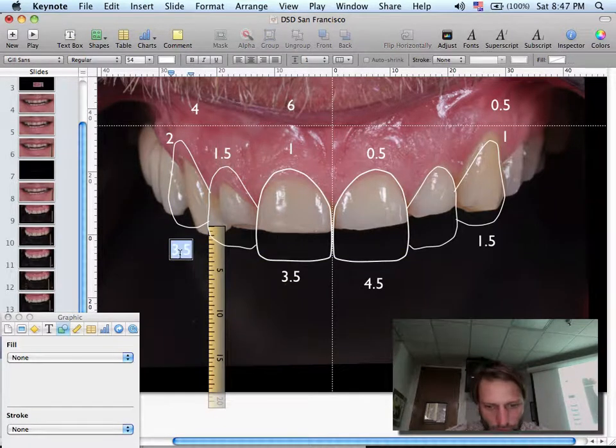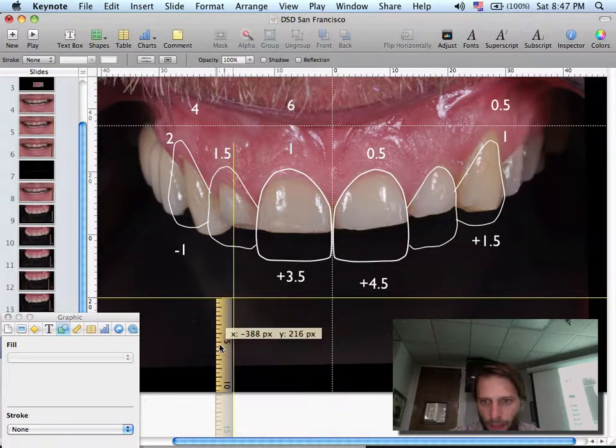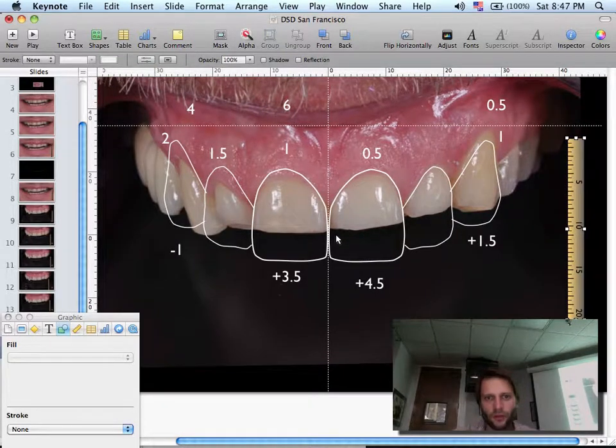Reduce, so you can actually put this plus. Something like this. And you can leave the ruler here so the technician can play. So these are the measurements. Measurements to transfer the cross, the cervical discrepancy, and incisal edge discrepancy.